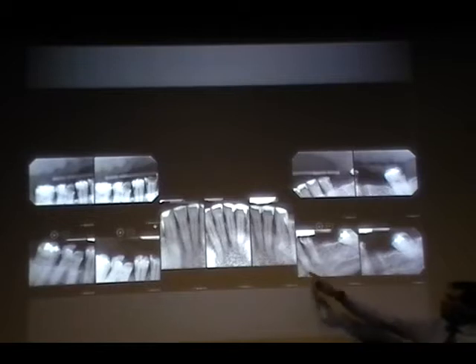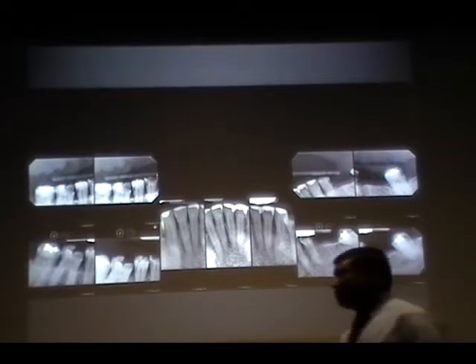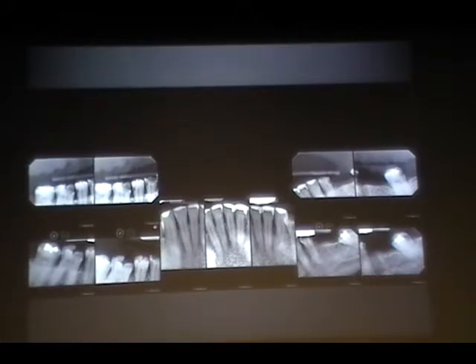How about this one? The next one. I'd say it's pretty okay. We can see the contacts. You can see the full tooth. How about the next one? I think the contacts aren't as open as you want them to be. Other than that? You just have to do it again. Horizontal angulation, right? Okay. How about this one?